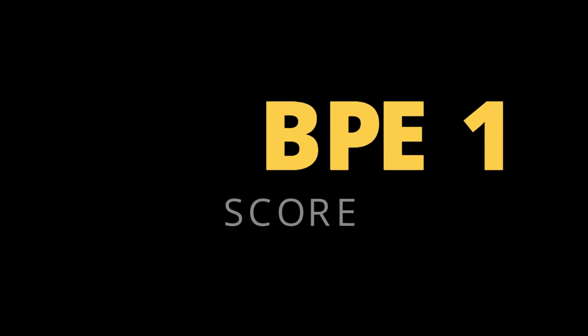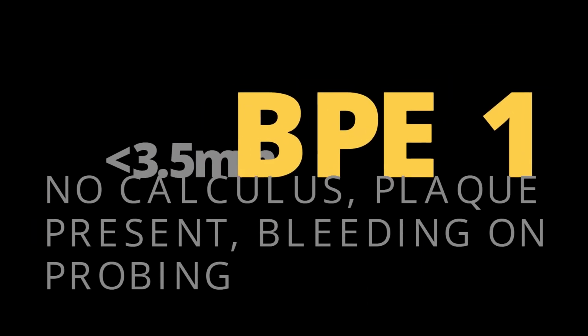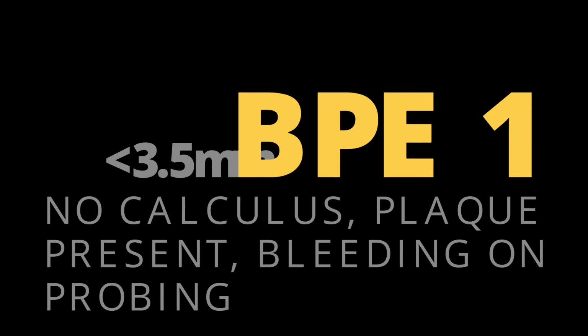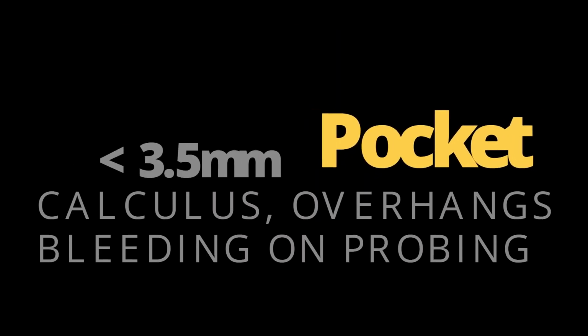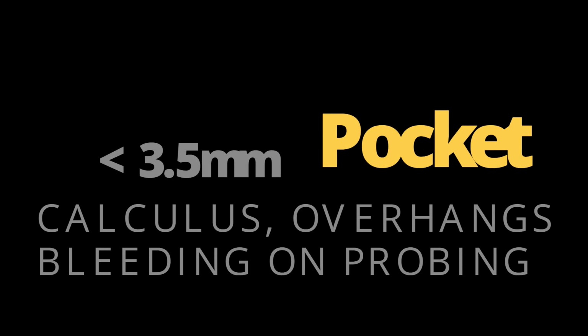This is where the pockets are less than 3.5mm, no calculus or overhangs, there's bleeding on probing, and the black band is entirely visible. BPE of 2. This is where the pockets are less than 3.5mm. There's supra or subgingival calculus and overhangs present, and the black band is entirely visible.